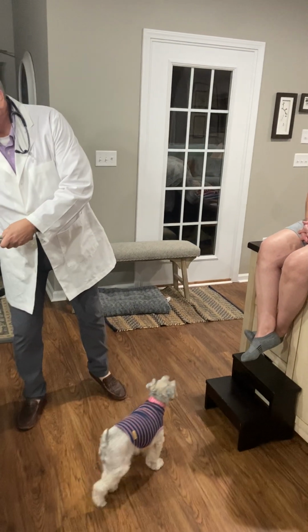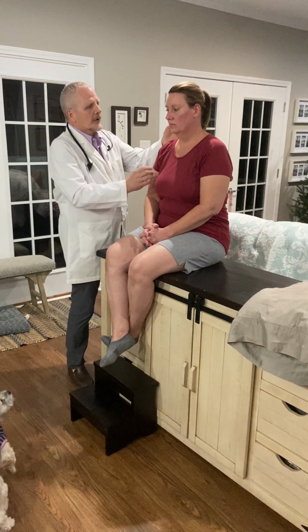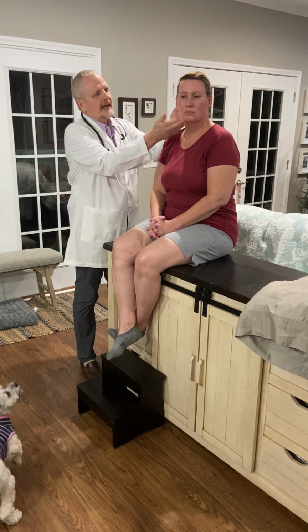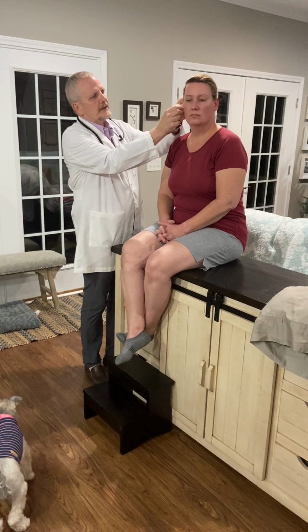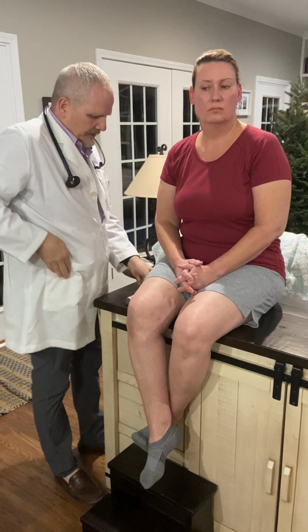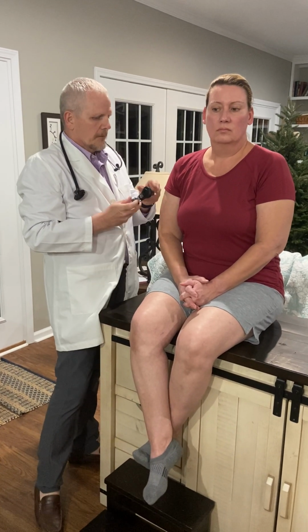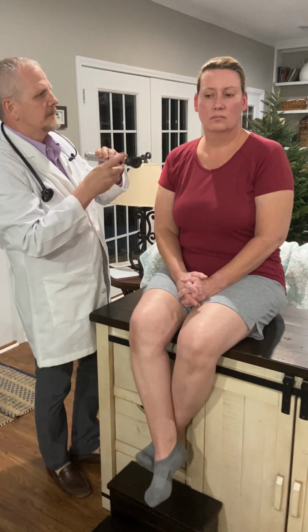Just change my head out. And we're going to inspect the outer part of the ear, the pinna and the tragus. We're going to assess it for any pain or discomfort. None is present. We're going to put a speculum on the scope, and we're going to look inside the ear canal.